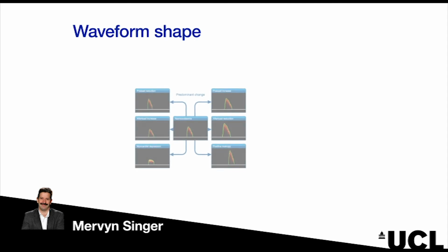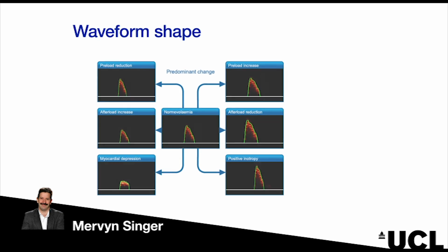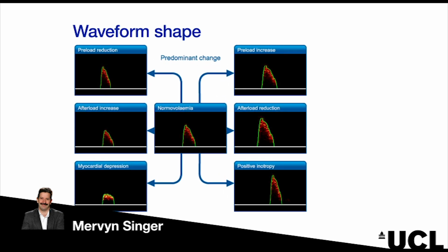So when you reduce left ventricular filling, the preload, the waveform gets narrower. The peak velocity doesn't tend to change too much until the hypovolemia is very severe. On the other hand, when you increase preload, the corrected flow time gets progressively longer with relatively less effect on the peak velocity. When you change inotropy, the predominant effect is on the peak velocity. It goes up with increasing inotropy and goes down with myocardial depression.